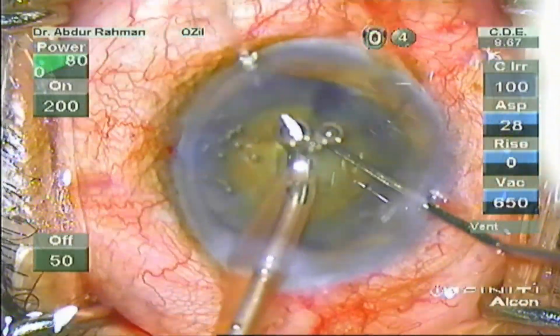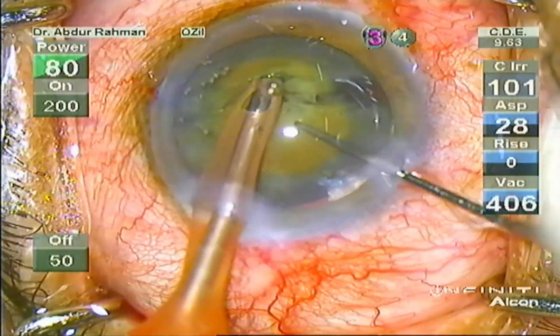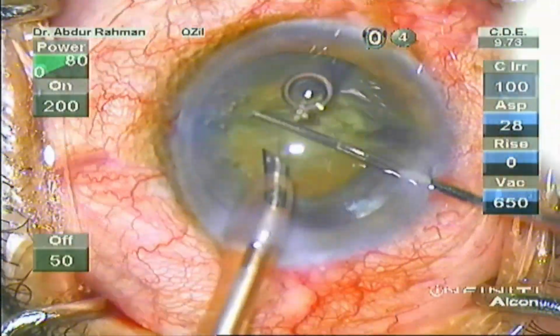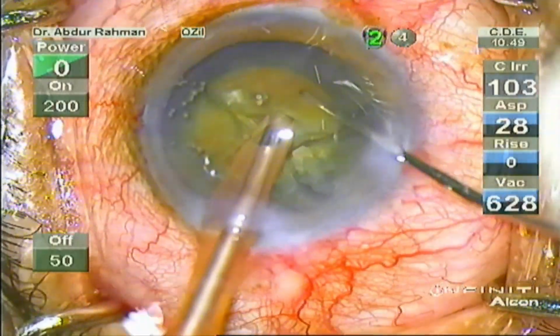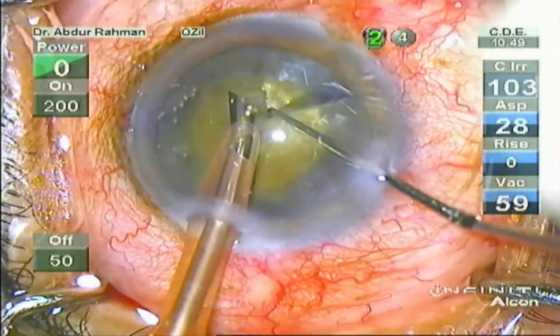Now two heminuclei are created, but they are somewhat attached to the central plate. Now continue chopping the two heminuclei into multiple small pieces.